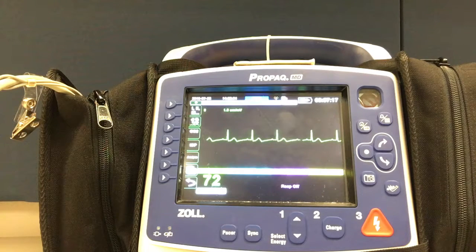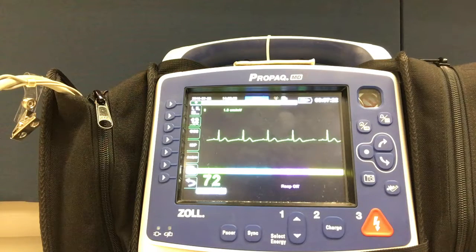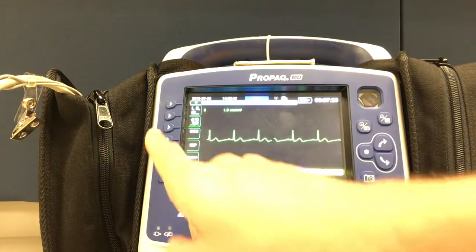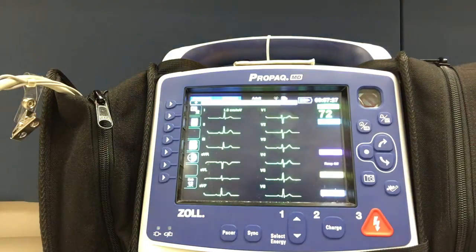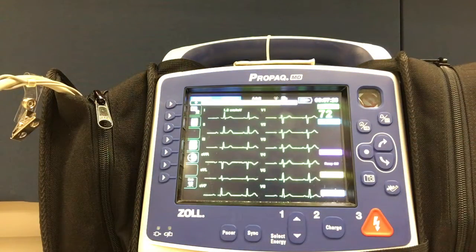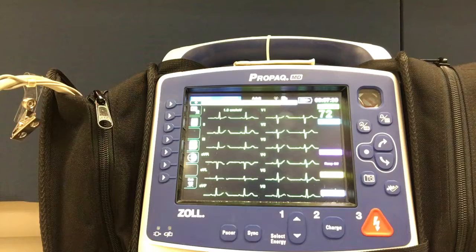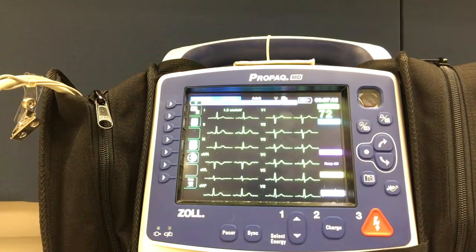We are now ready to capture the 12-lead EKG. From the home screen, press the button to the left that depicts the number 12. The button that depicts a clipboard is where we can enter the patient's demographics.